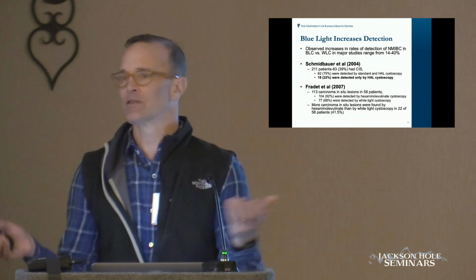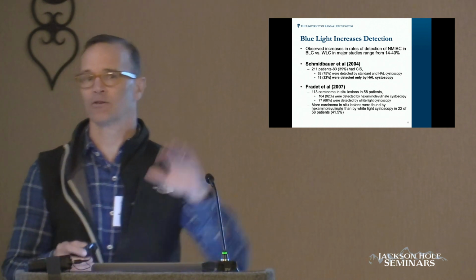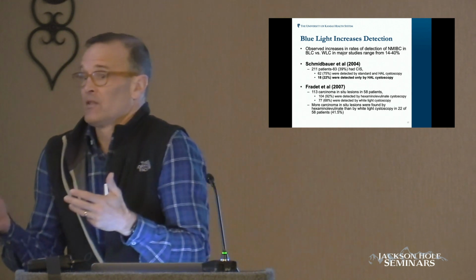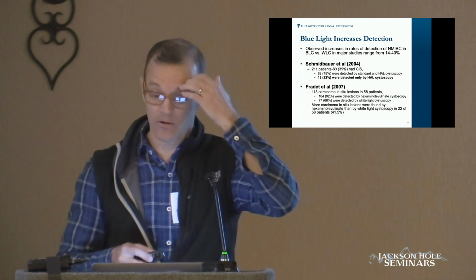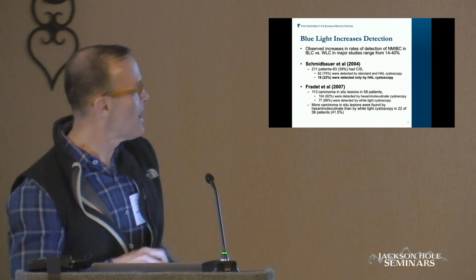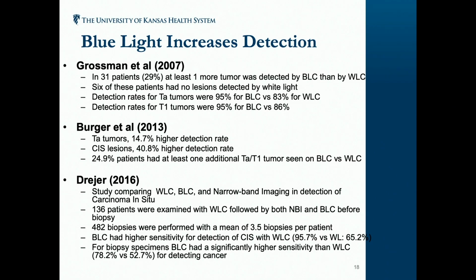Well, obviously that depends on who's doing it, right? If you have a lot of experience in bladder cancer, it's probably not at that 40%. If you don't have a lot of experience, then it's probably a little bit higher on that 40% increasing your detection rate. But it just depends on the study where you're seeing that come through.